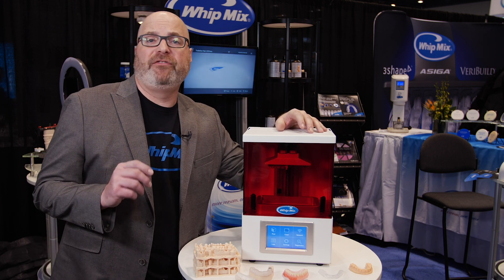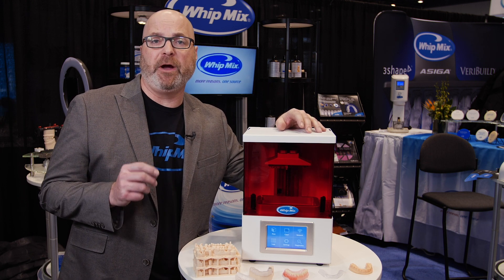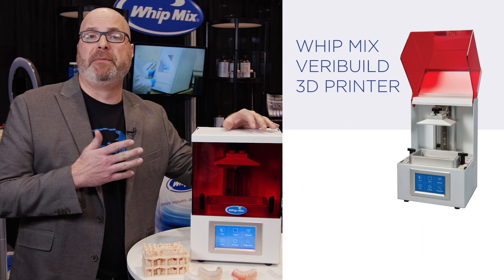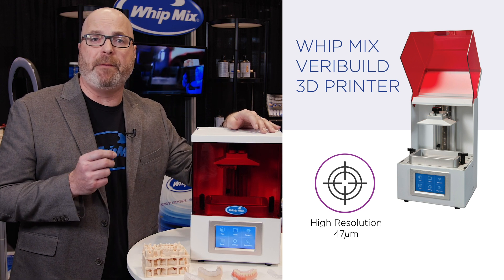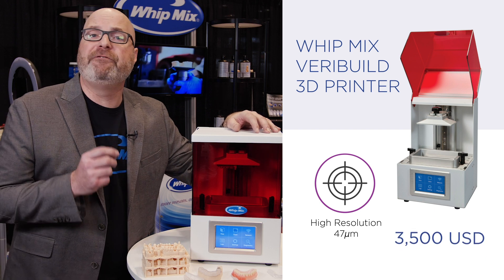What we found is that the market was lacking an economical, low-cost 3D printer that was still very accurate. So with the Whitmix VeraBuild printer, we are bringing to market a printer that is 47 microns of accuracy in the XY for $3,500.